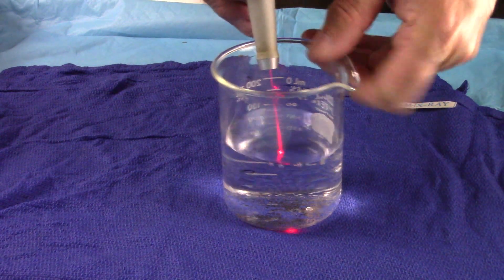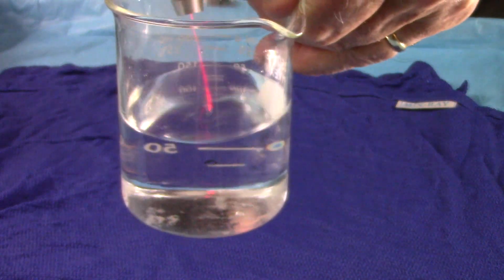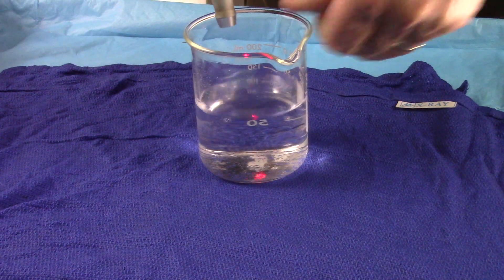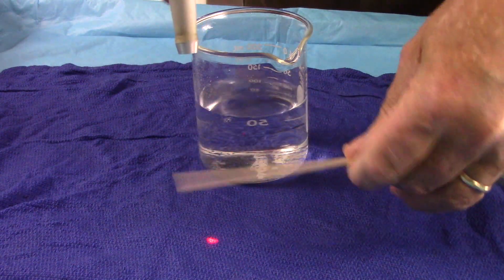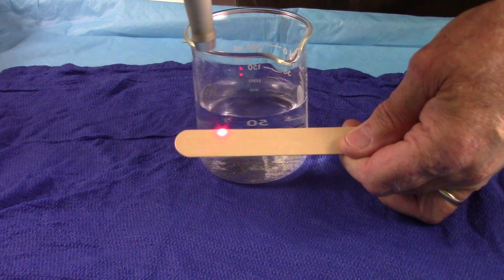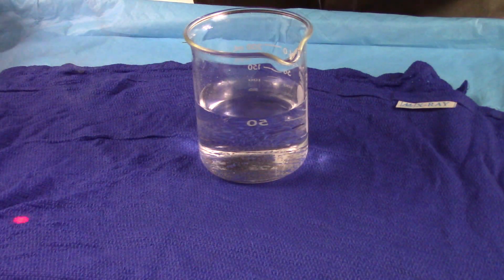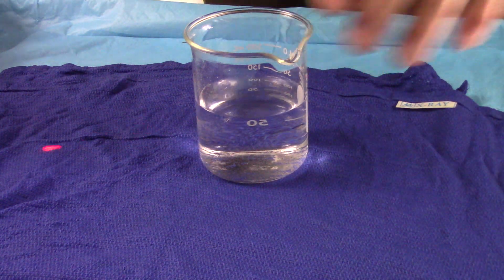I'm activating the laser right now and essentially it just boils it through the fluid. Now the laser definitely is working because if I put a tongue blade out here you definitely see the flames and the smoke with it.